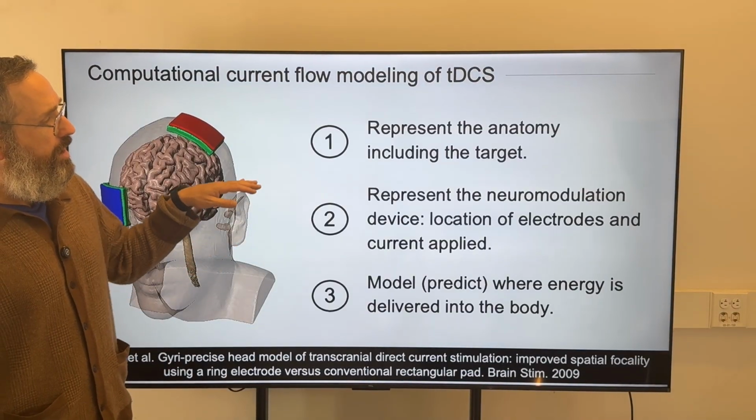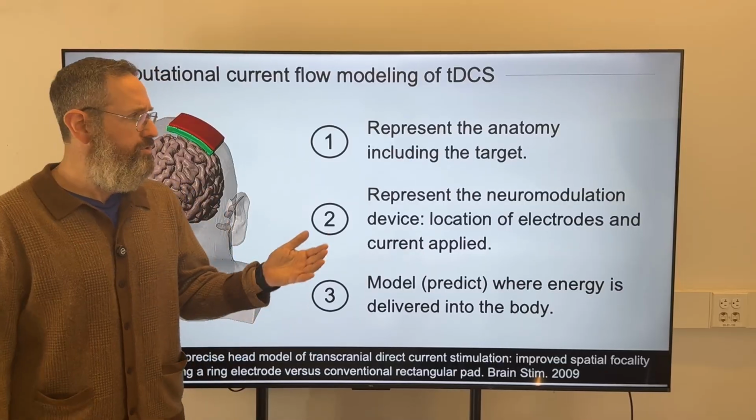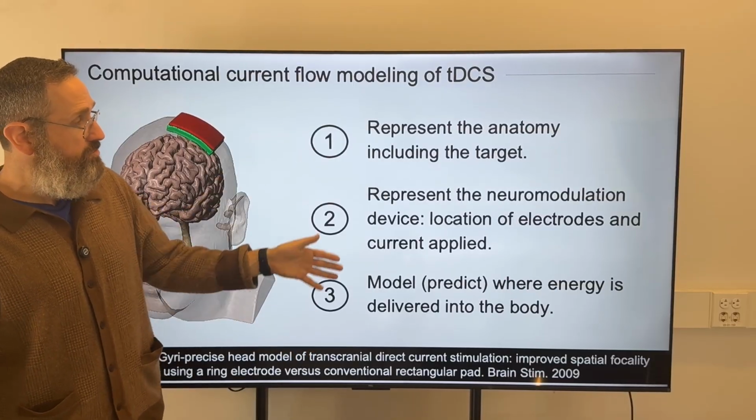Okay, now without getting into more technical details than we need to, all computational models, including the one I'm showing you here for tDCS, have just three basic steps.